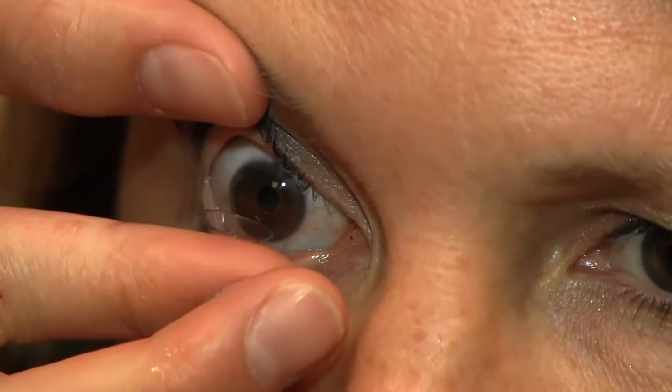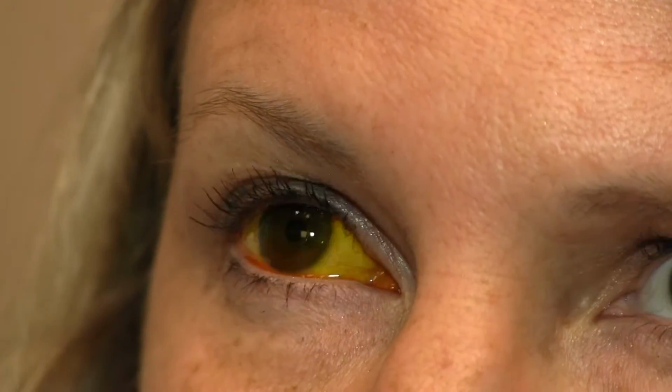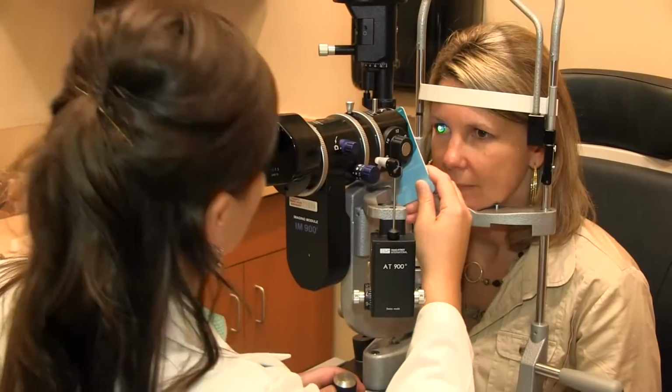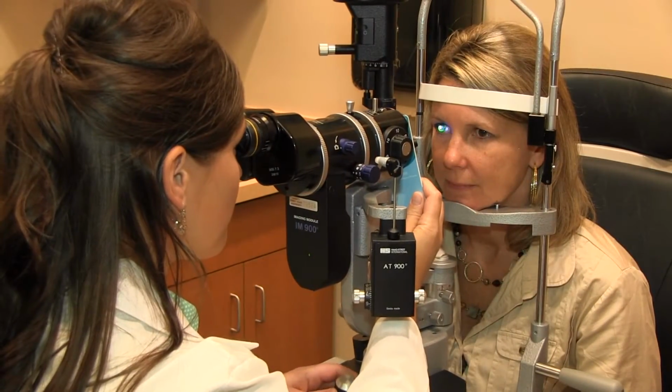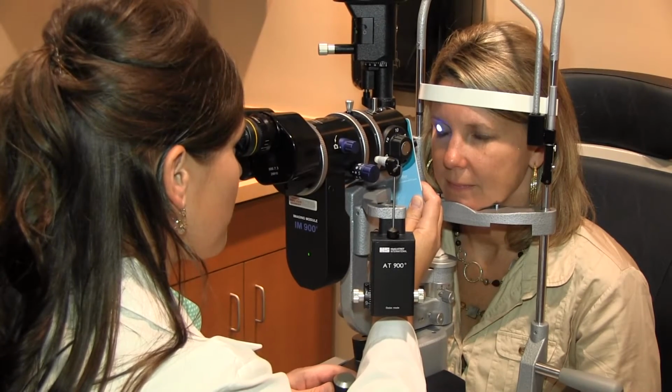After receiving the empirically ordered lens, the lens will be placed on the eye and fluorescein will be instilled to evaluate the fit. Let's now move on to look at a few ideal lens fittings. Remember that a Wratten filter can enhance your evaluation, and many times slit lamps have a Wratten filter built in.